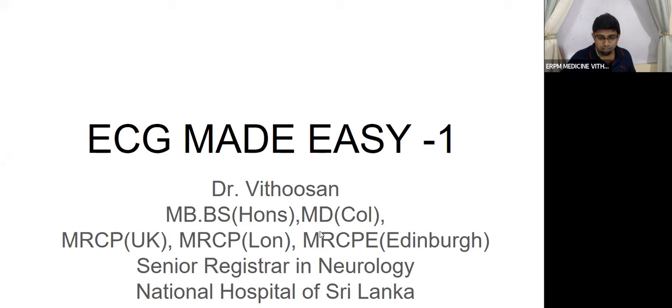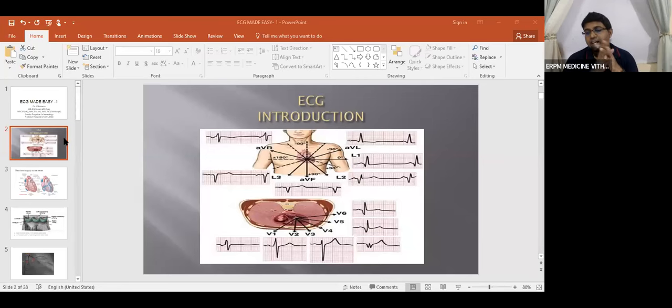The second thing: what we are trying to do with the ECG is, as you're all aware, record the electrical activity of the heart.